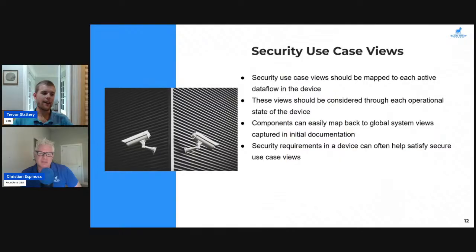That's a great question. And DICOM's specifically a really difficult problem to cover due to the fact that it's such an old format, and it has so many inherent vulnerabilities that can be a little bit difficult to bridge even with modern technology.